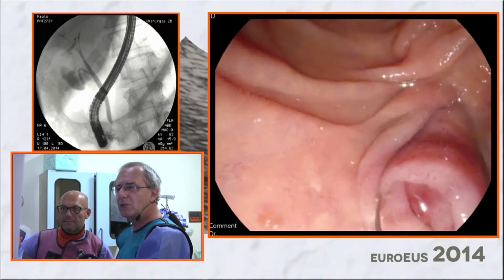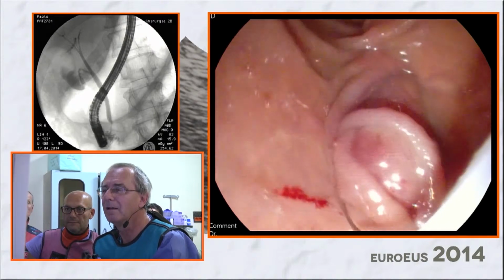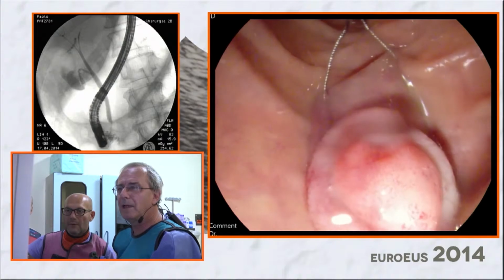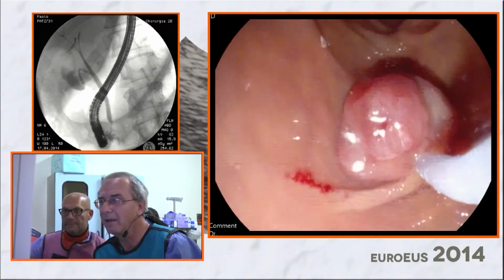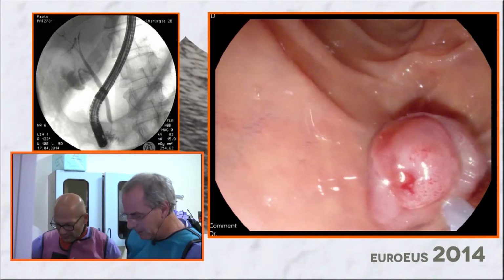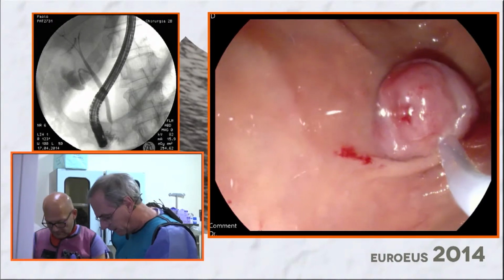I try to catch the whole thing. Okay. Now close slowly. Close. Okay. I think I've caught everything. And then we'll see. Now we will do the cut.